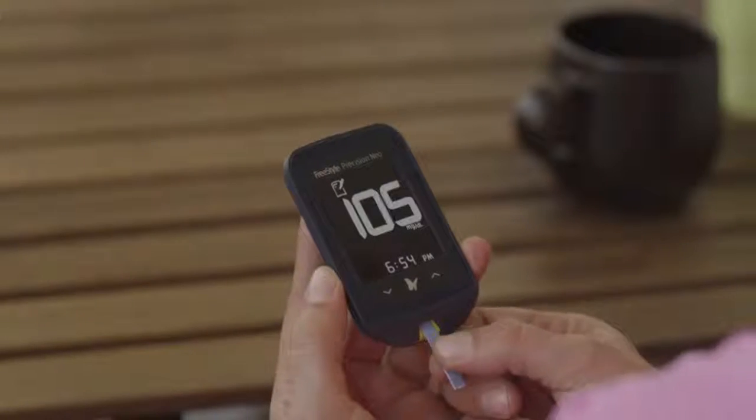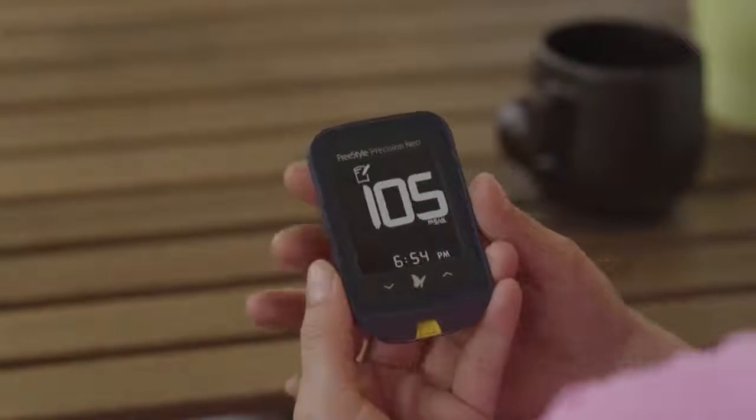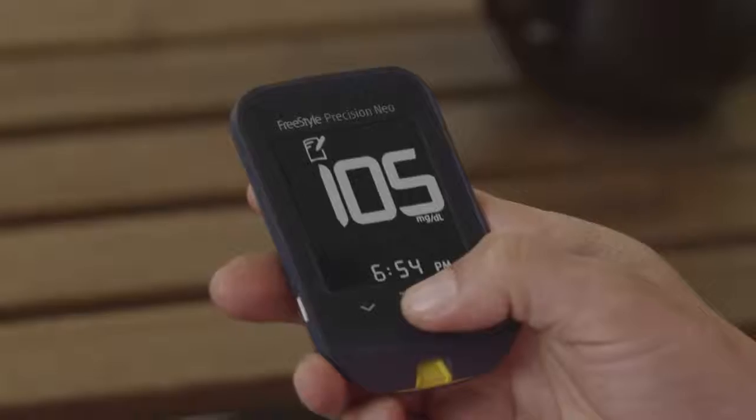The meter will display your result — that's it, your test is complete. Remove the test strip and hold the butterfly icon to turn the meter off. You have now performed your first blood glucose test with Freestyle. Welcome to the family.